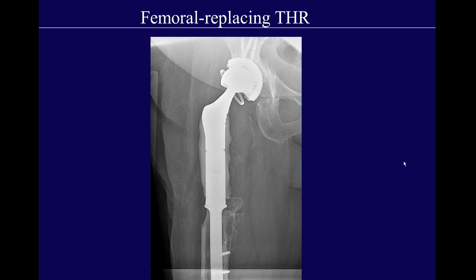Sometimes when patients lose complete bone stock, or in cases of tumor requiring resection of a large piece of bone, you'll see a femoral-replacing total hip replacement. This patient has no more bone stock, either because of osteolysis or resected tumor. They've placed a bipolar constrained dual mobility prosthesis here, replacing any proximal bone that would have been there.